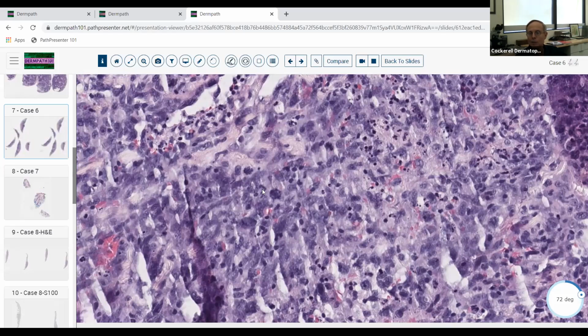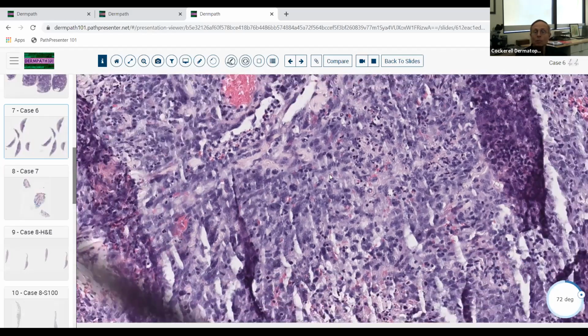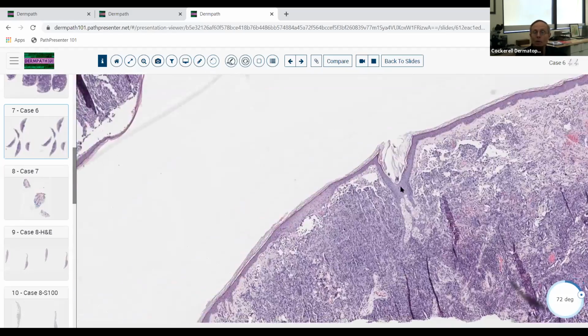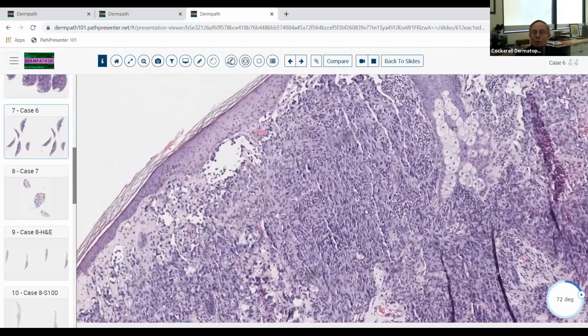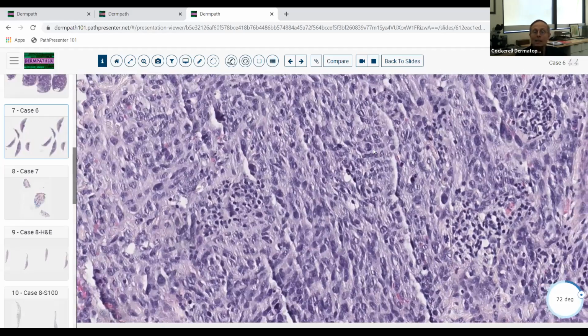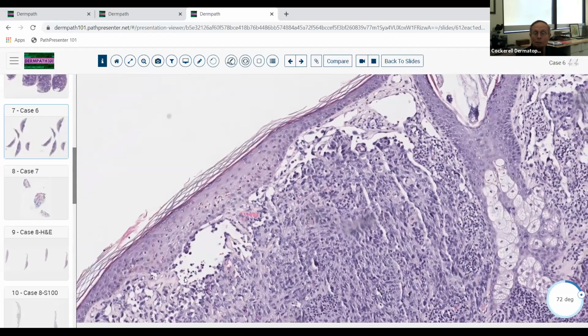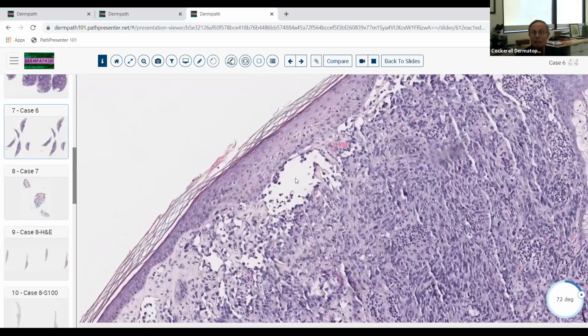And there's a type of angiosarcoma that can be epithelioid, meaning it looks like an epithelium, but it's really not an epithelium. And that's actually, if you just have this sort of focus right here, an example of what we're looking at here. So this is an example of a so-called epithelioid angiosarcoma in this area that has areas in which there are blood vessels here. So thank goodness the vascular area was sampled, because it provided us the ability to make the diagnosis.